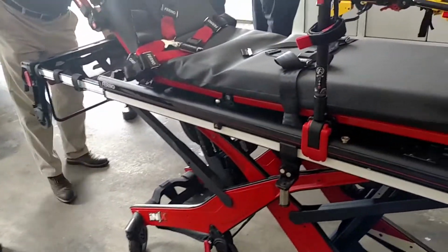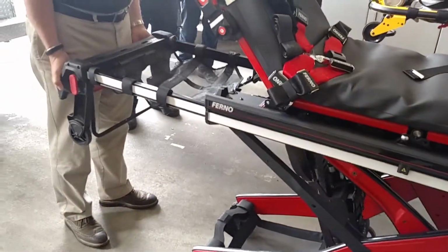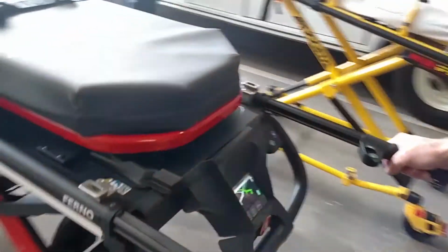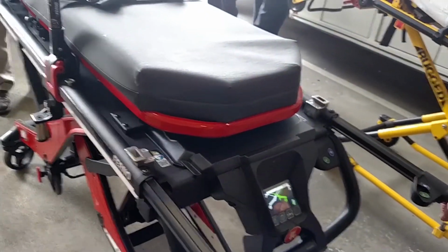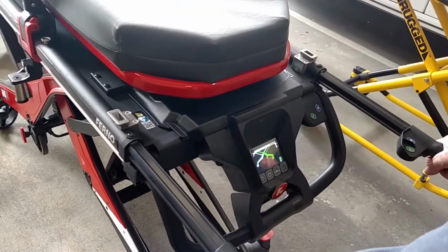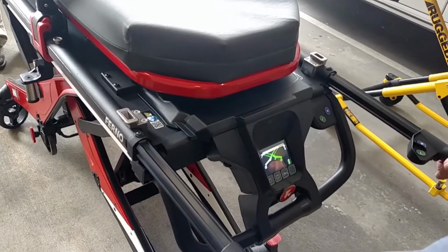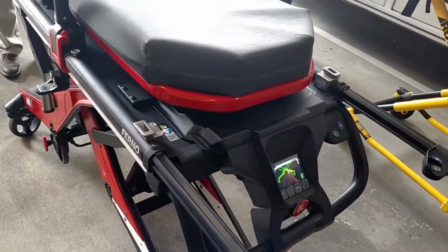So let's say I'm putting pressure on the load wheels, okay? Watch what happens to the screen. It should tell you which legs are active, because they'll be green. Front ones. Now all four are active. So if I put pressure on this, it's putting pressure on a switch inside the actuator. Now go ahead and do the same thing to the rear.